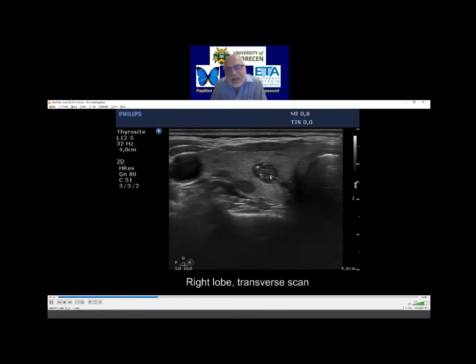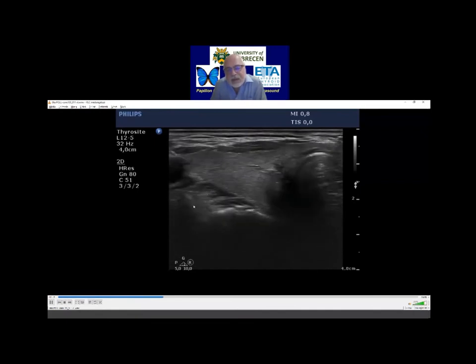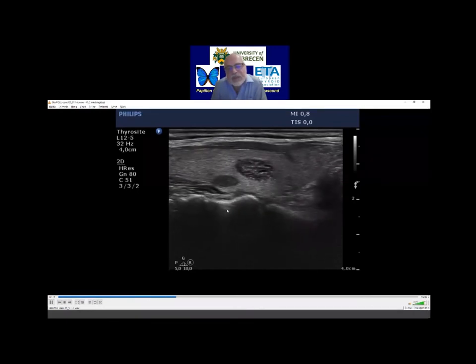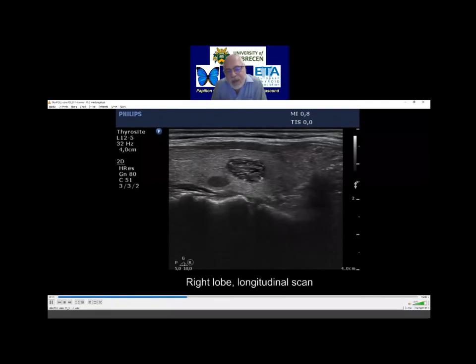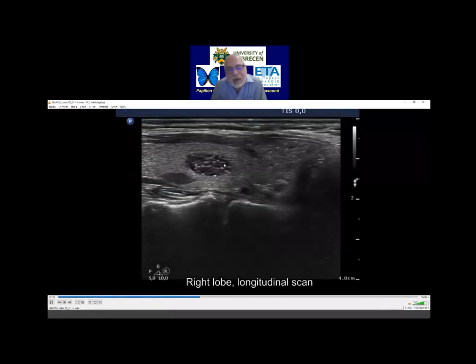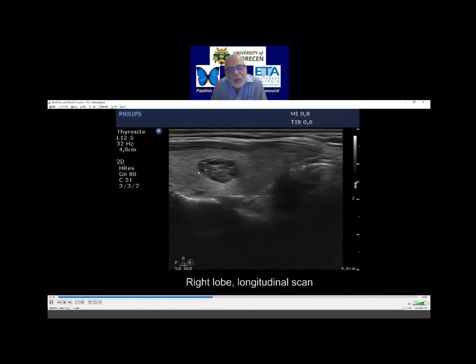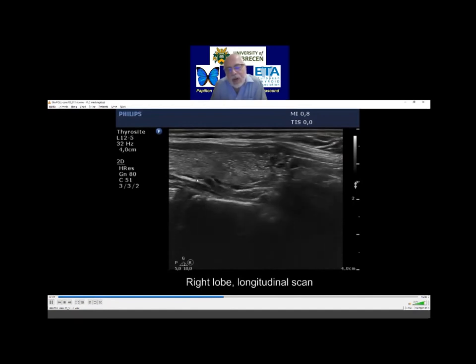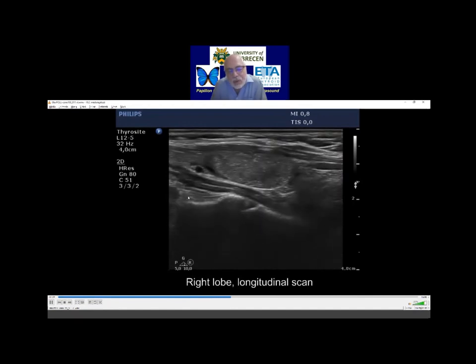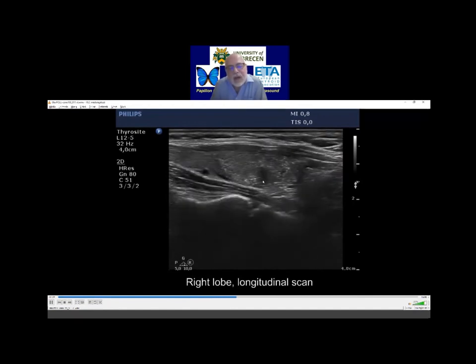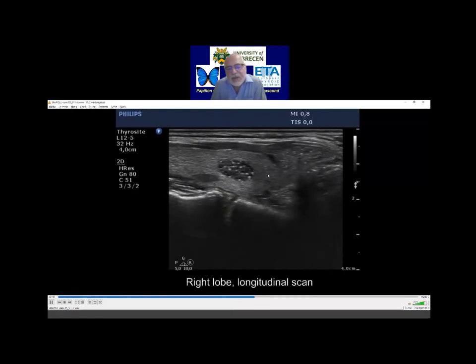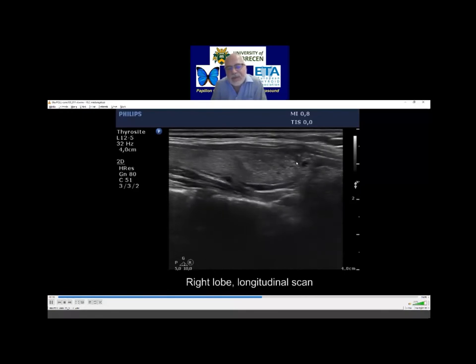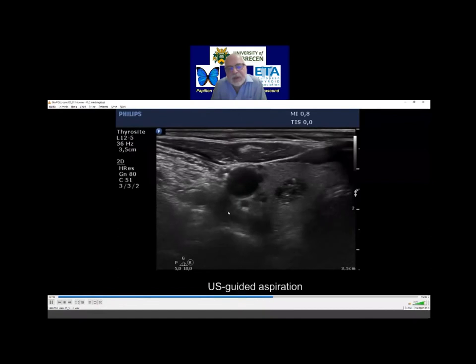These figures in the smaller nodule are mostly related to ventral cystic areas — not large, but small — and almost all are located dorsal. In this case, a very limited amount of cystic fluid can be seen.